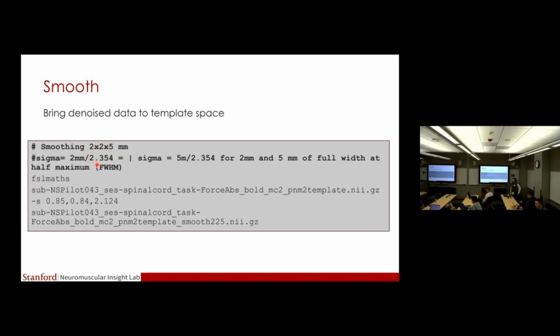So as discussed also today, why do smoothing as opposed to acquiring bigger voxels, which gives you more SNR? I guess the decision was, well, we want the smaller voxel, but when we were building the sequence, we hadn't really thought about what we were going to do downstream, what we were going to smooth it with.